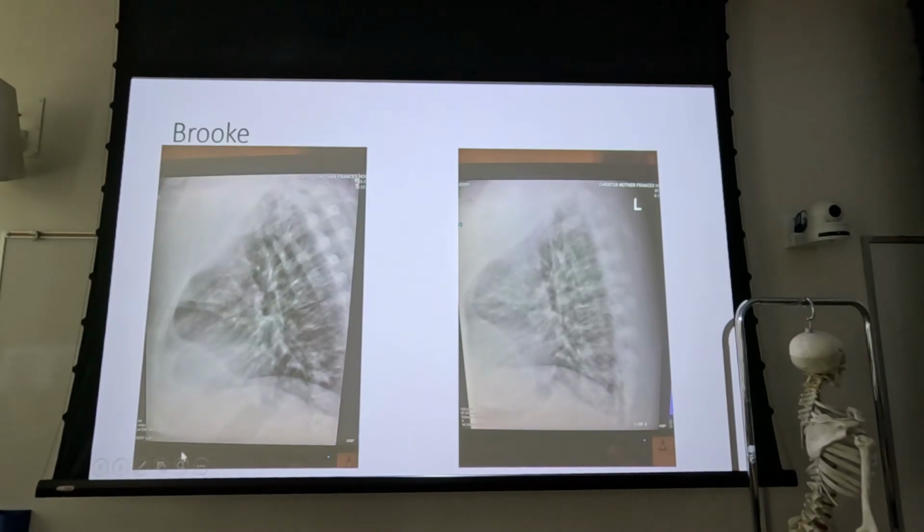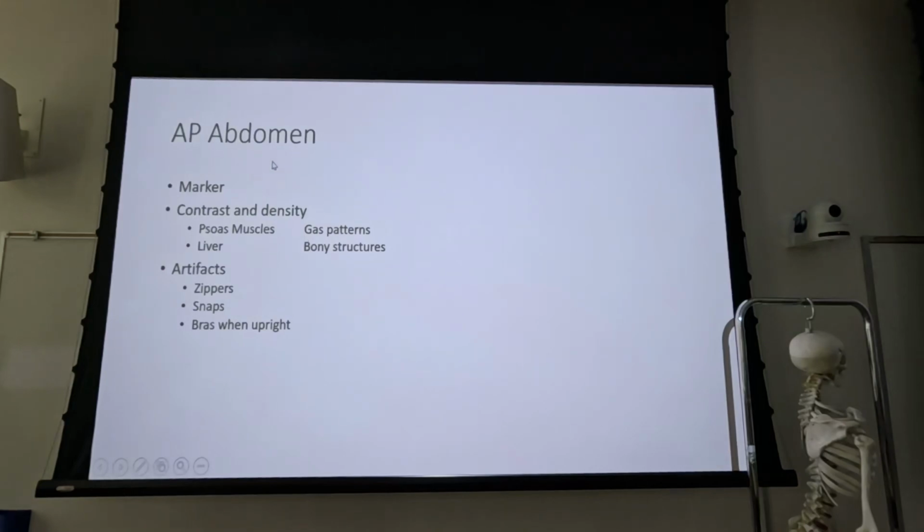You could have put it way down here. You could have put it up here. I really don't care. But certainly follow, you know, we used to have a radiologist who used to be an RT down in Jacksonville, and he was really particular on marker placement and orientation. So follow hospital or doctor protocol, but if there is none, then just get it on the image and get it out of the way.